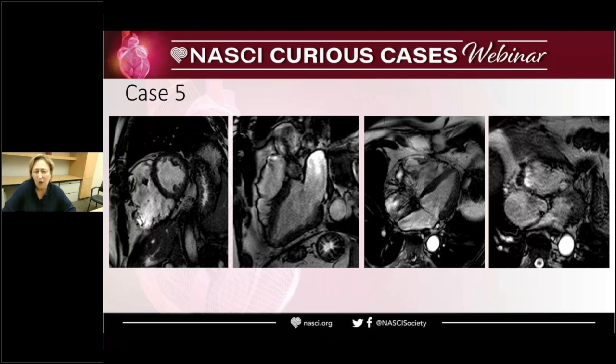And then on the cine images, remember this patient has an ICD, and it was really difficult to perform this study with better quality. So I apologize for the image quality, but the study is diagnostic, and very exciting as well. We're looking at the SSFPs. This is a short axis. This is a sort of RVOT, kind of two-chamber oblique, and then this is a four-chamber view, and this is a stack of axial images as well. So anyone who wants to elaborate on what we're seeing here, and what perhaps could be the diagnosis.